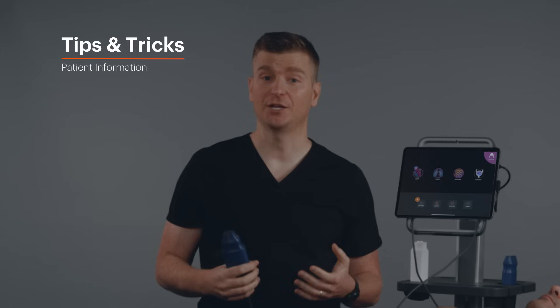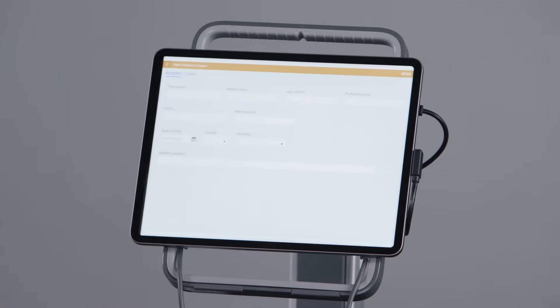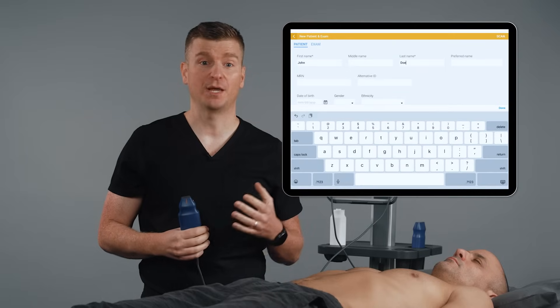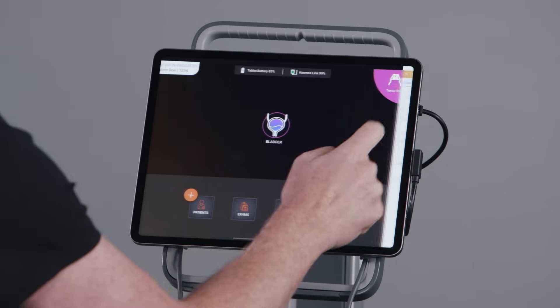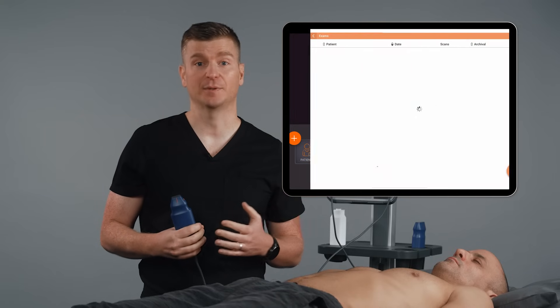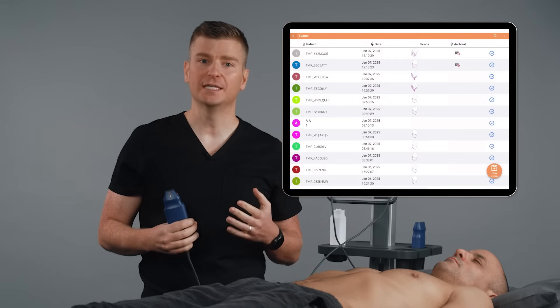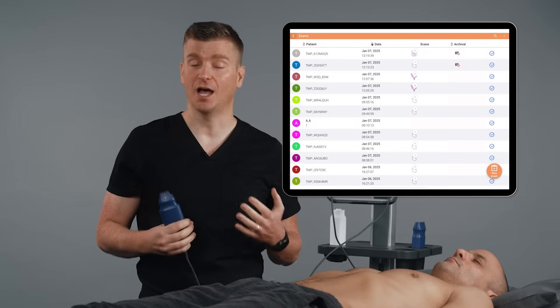If you want to assign patient information to your scan, simply press the plus icon. Enter in the relevant patient information and then hit scan. From here, complete the scan as you would normally. To pull up the saved scan, select the exams button. The exam will be listed with the patient information you previously entered, as well as other saved exams. Exams completed without patient information will be assigned a temporary ID, as well as a date and timestamp.